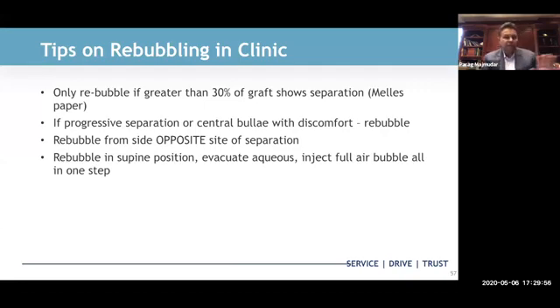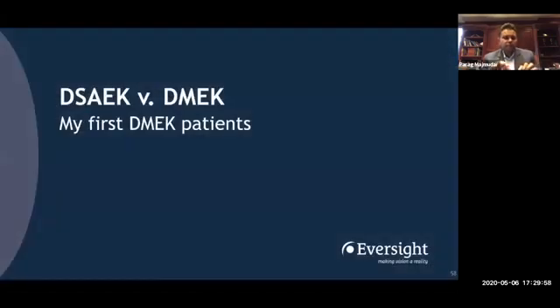I've done 99% of these when I do them in the clinic, at my slit lamp, with no other use of resources. You don't have to take them back to the operating room or anything else. You can't bill for the rebubbling in the clinic, but that's fine. Most of these patients, I rebubble often just to keep them on course, not have such a prolonged course. So I don't want them to take 2-3 weeks to attach. I want them to attach, hopefully, within a week to 10 days would be my goal.